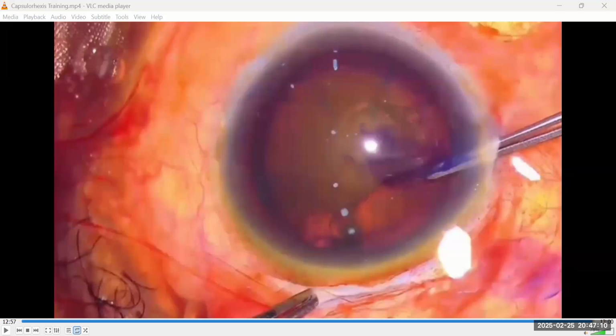You can primarily decide to do a double rhexis, or you can continue with what is called a spiral rhexis. Double rhexis is planned by the surgeon. A spiral rhexis is where you anticipate danger and initially went ahead for a small rhexis, only to discover that the danger was overrated. You can now continue as spiral rhexis. I'm not sure anybody initially will just go out to do spiral rhexis. Usually, most times, the danger you anticipated was just overrated. So you can now continue as a spiral rhexis.